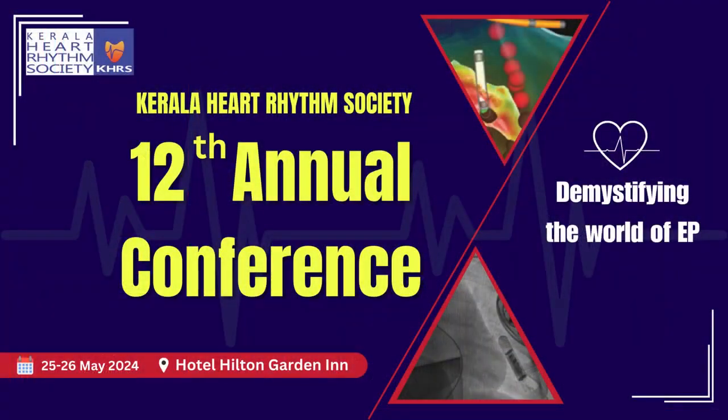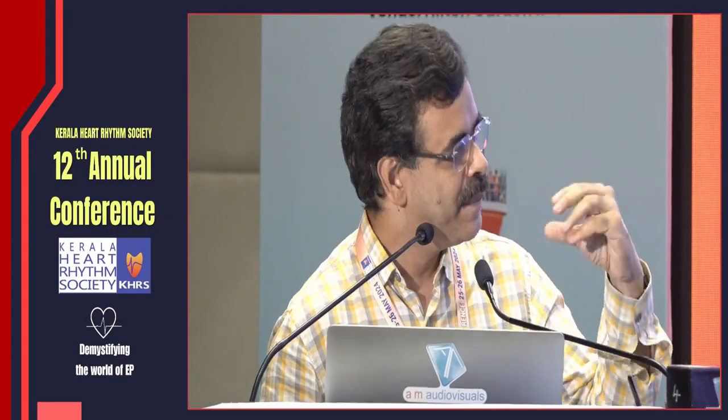One good thing about left bundle pacing is we are not limited by a small area. We can capture whether it is the anterior fascicle or posterior fascicle. Many times it goes to the posterior fascicle. But as long as our QRS remains narrow, I think we should be okay with it.